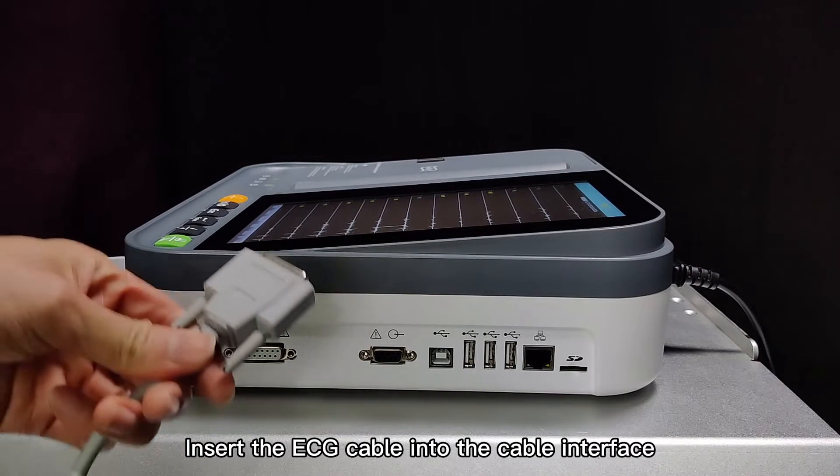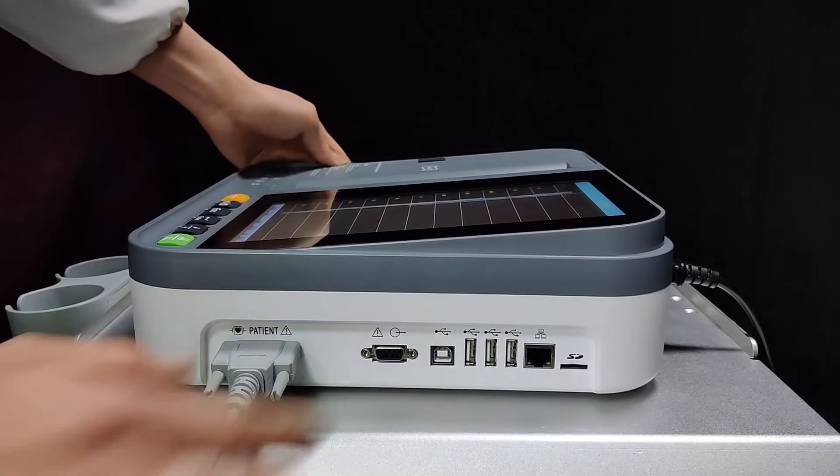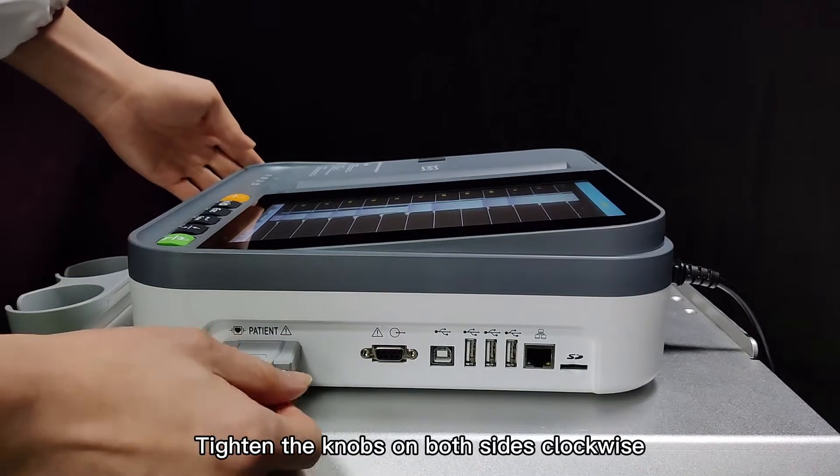Insert the ECG cable into the cable interface. Tighten the knobs on both sides clockwise.